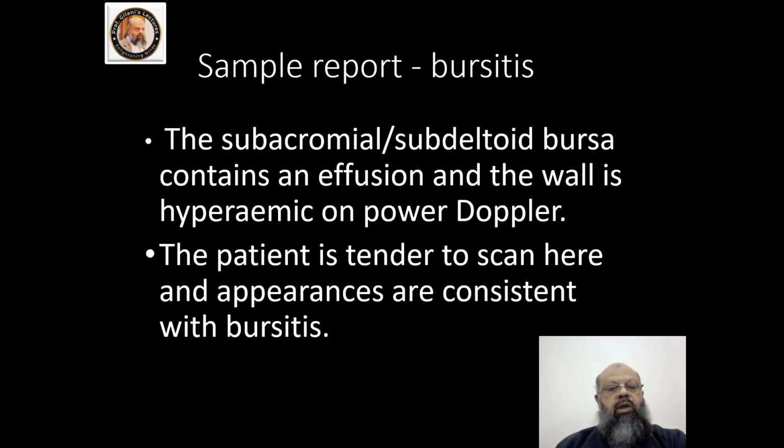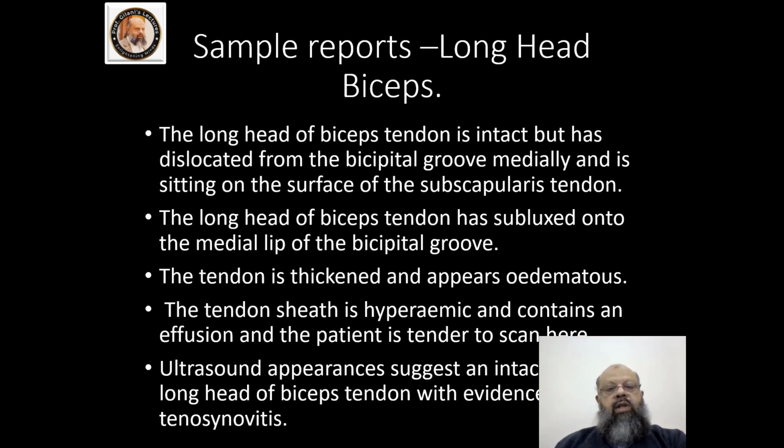The subacromial subdeltoid bursa contains an effusion and the wall is hyperemic on power Doppler. The patient is tender on scanning here and appearances are consistent with bursitis. A sample report for the long head of biceps. We can say that the long head of biceps tendon is intact but has dislocated from the bicipital groove medially and is sitting on the surface of the subscapularis tendon.